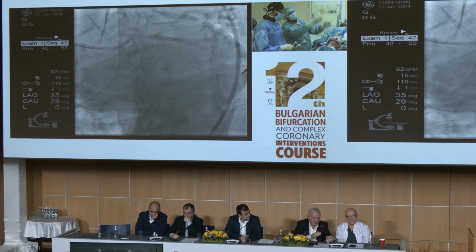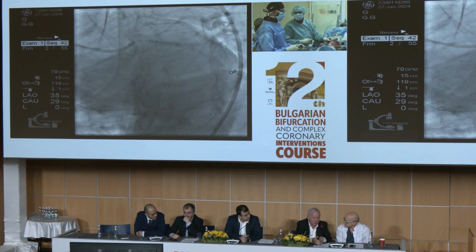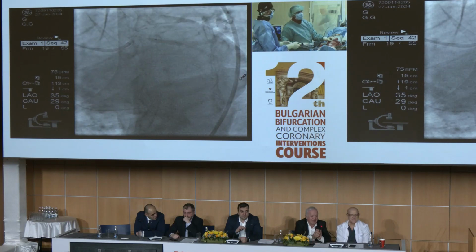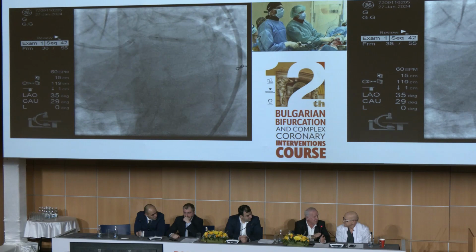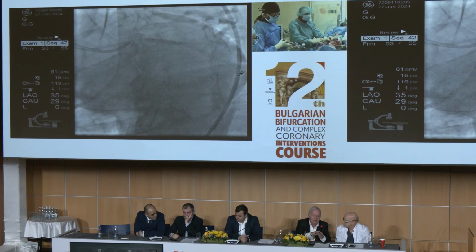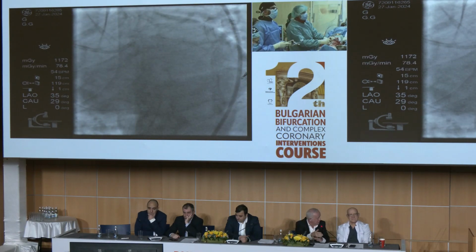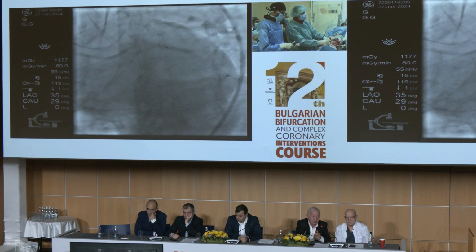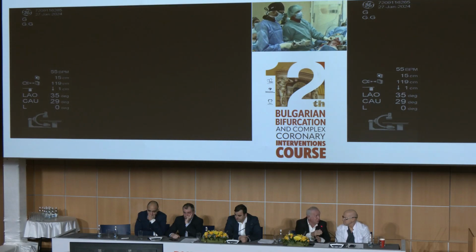Yes, but I know this study, but the problem is not in the choice of the balloon. The problem is the way you use the balloon to deploy a stent. 5 seconds cannot deploy your stent, I can prove it, because, as I already told you, the first inflation is not reaching the nominal curve produced by the company. So you get the nominal curve only at the second inflation. And if you inflate 5 seconds, you will never reach the nominal.